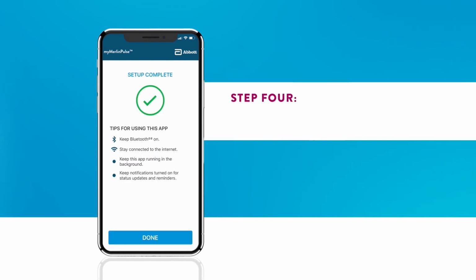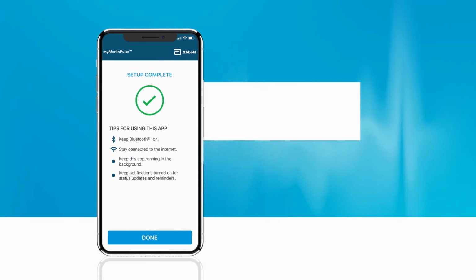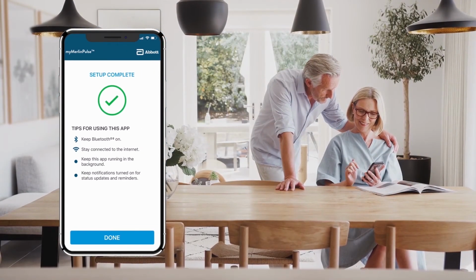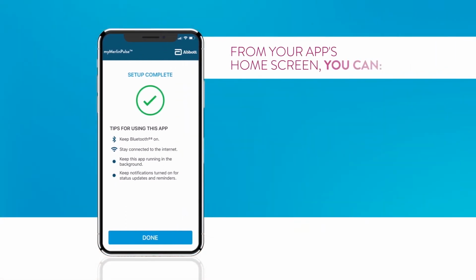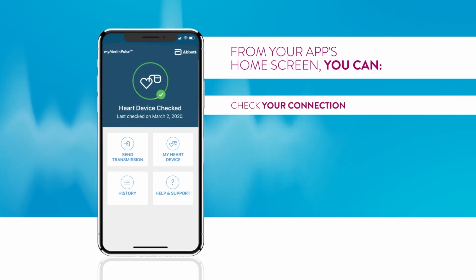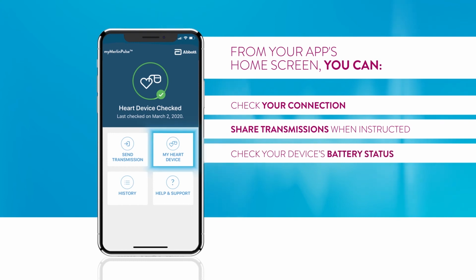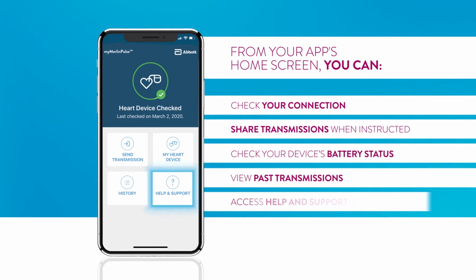Step 4. Your setup is now complete. Your Abbott device is paired with your iPhone, and the myMerlinPulse app can securely collect and share your heart rhythm information with your clinic. After you click Done, you'll be brought back to your app's home screen. From here, you can check your connection, share a transmission with your clinic when instructed, check your device's battery status, view past transmissions, and access help and support resources.